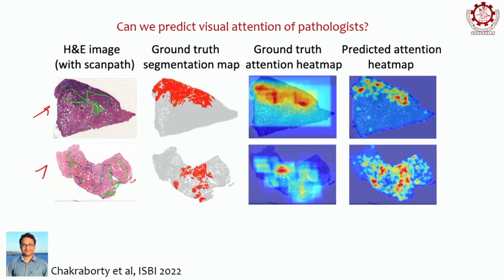So essentially tissue that has been taken, and then traditionally the pathologist would look at it under the microscope, but you can always digitize it with a high powered camera. And then instead of looking under the microscope, pathologists can look at these images on the screen. They can zoom in, zoom out, they can pan, and whatever they want to do with the image, and they arrive at their decisions.